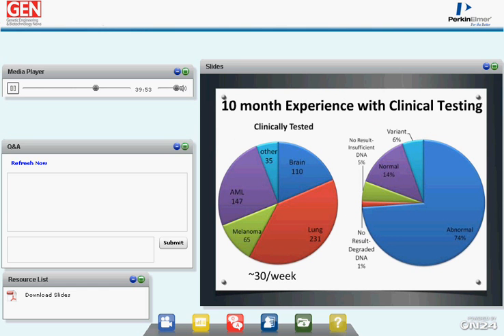In terms of diagnostic yield, about 75% of them, we're identifying at least one disease-associated change. So this means when we look across the literature that the mutations we see in the specimen have been reported previously as a pathogenic change in some tumor type. And so this is a really high number. Only 14% of cases are coming back normal, meaning we haven't found what it is we're looking for, and this just means we need to expand our content in our future versions of the panel.